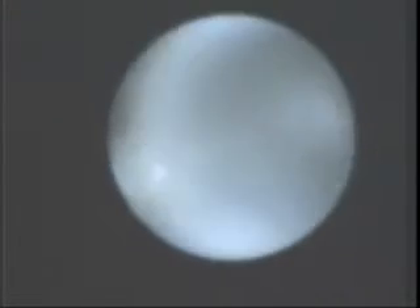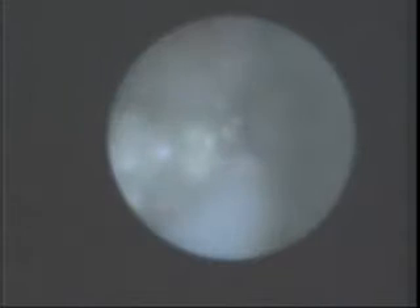In this particular case there's an abnormal overgrowth of enamel on the side of the tooth below the gum line, and it's causing a gum problem because the patient can't clean there. We've designed these diamond-coated ultrasonics that are about 0.7mm in diameter at the tip, vibrating 25,000 times a second. I'm pushing firmly on it and those diamond edges are cutting that enamel off the root of the tooth down below the gum line.